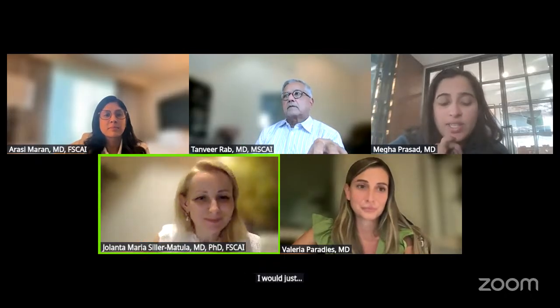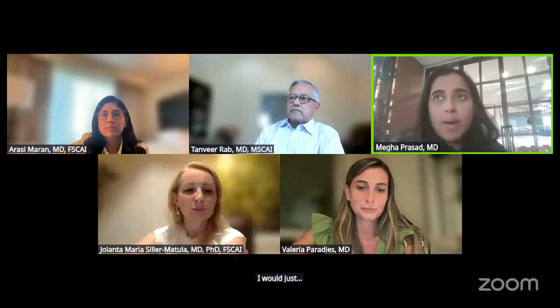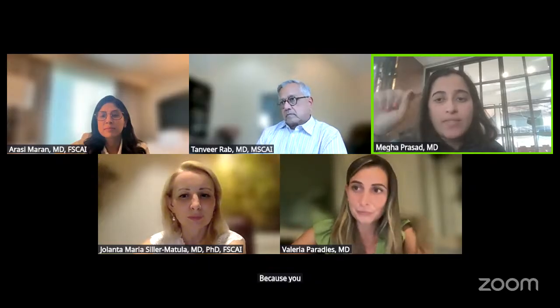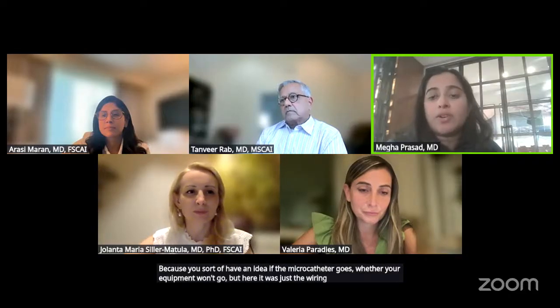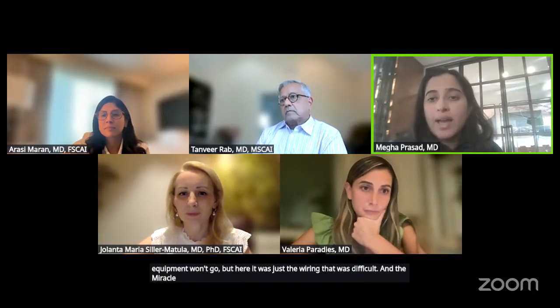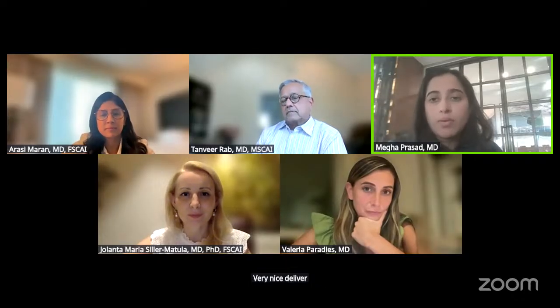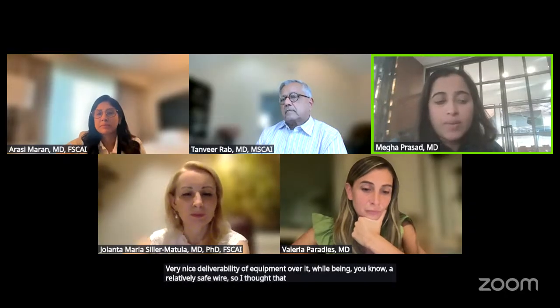I was just going to say just a couple quick comments. I think something I've started doing is using a microcatheter up front to wire in, because you sort of have an idea if the microcatheter goes, whether your equipment will go. But here it was just the wiring that was difficult. And the Miracle 3 is really a nice choice because you have very nice deliverability of equipment over it while being a relatively safe wire. So I thought that was very clever.